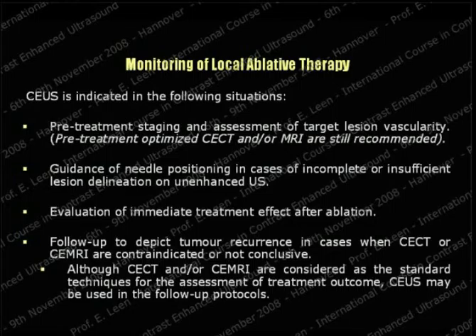So these are the indications now for monitoring RF ablation. The first one I said to you is re-staging, an assessment of the target vascularity. Now remember, this is not to say that you don't use CT or MR, by the way. Okay? So that's why this statement is put behind. Now, second, to guide needle position, because quite clearly there are lesions that you can only see with contrast. So how do you go about targeting the lesions that you don't see except with contrast? And I'll show you by the use of the dual screen in a later slide how you could do that.